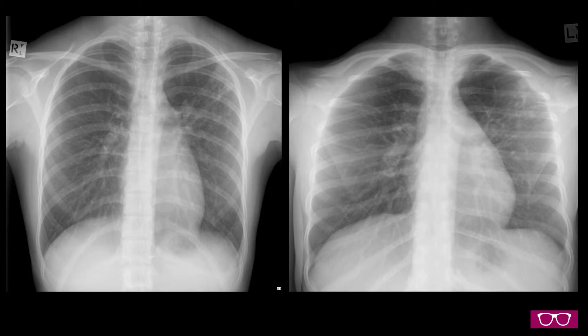If you have a look at the left lung apex, you can see there are some nodular opacities, certainly seen on the PA projection but a lot more clear on the apical lordotic view. Looking at the right, it's hard to say — maybe there are some nodules at that right apex, but certainly not as clear as the left-hand side.